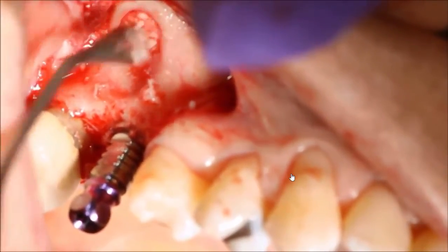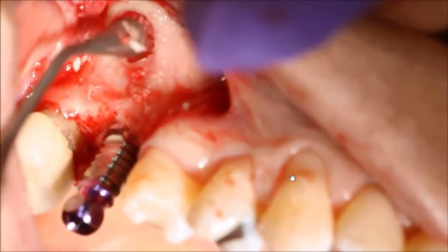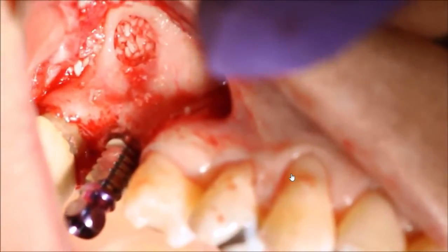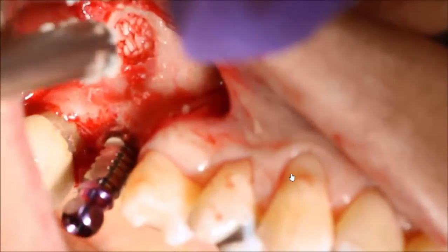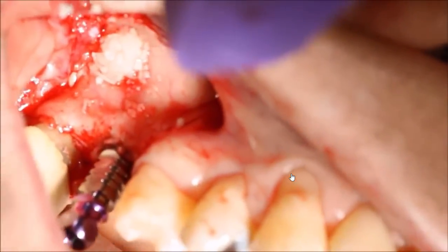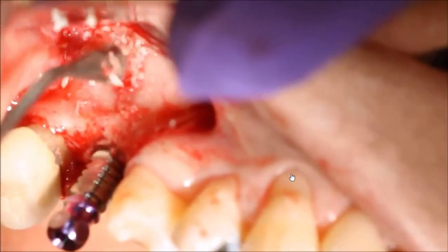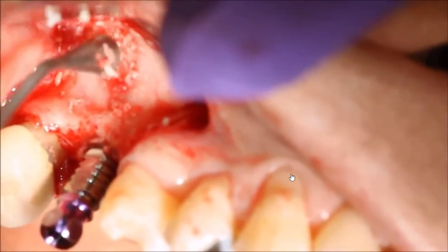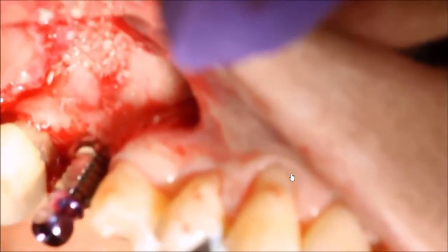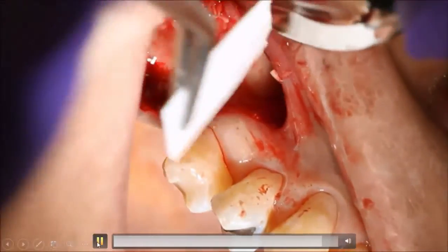وبعد ما ننتهي من البون جرافتينج لازم نغطي الويندو بممبرين. It's very important to cover our window with membrane to isolate the bone graft from any soft tissue invading. لازم نحن نعزل الويندو والبون جرافت تبعنا بممبرين حتى ما نخلي السوفت تيشيو تبع الفلاب يدخل ضمن الجيب، وبالتالي بصير في عنا فشل.